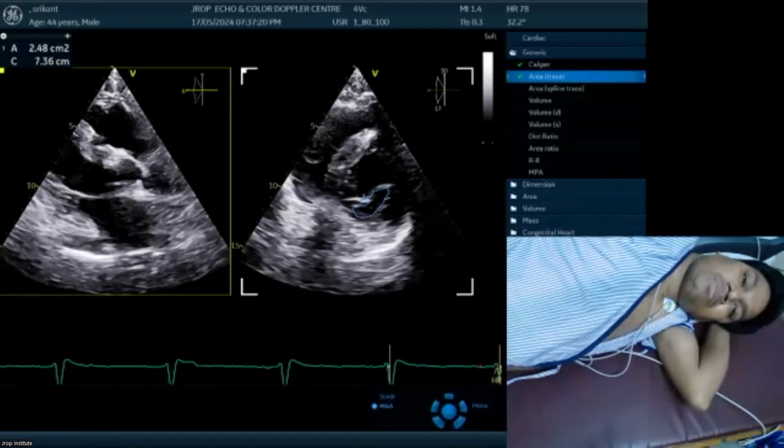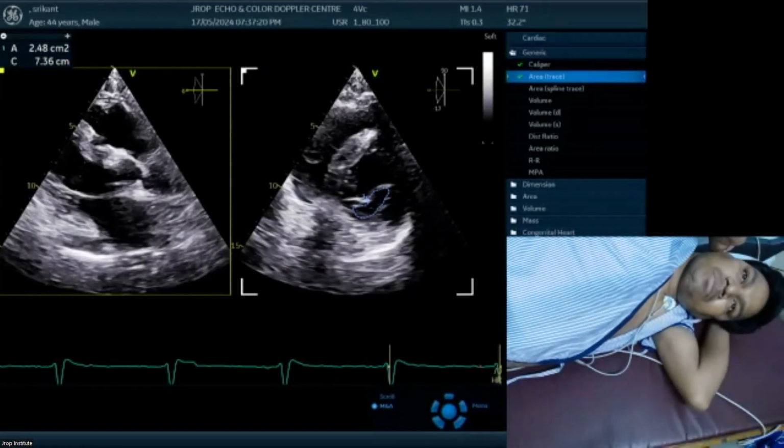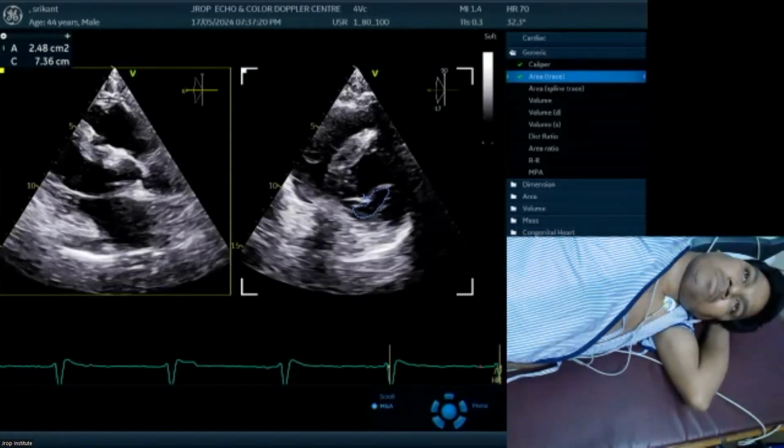Dr. Sachi Surendran: Sir, what is the basic difference between velocity and velocity time index, VTI? Velocity and velocity time integral, not tissue index. Velocity is a point where you can measure point velocity.